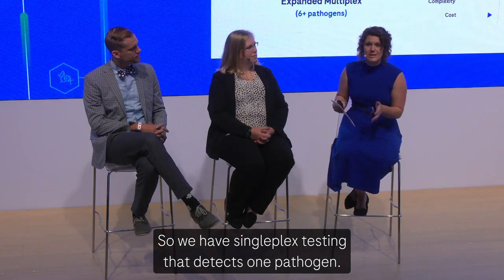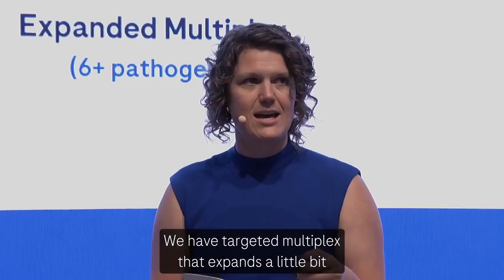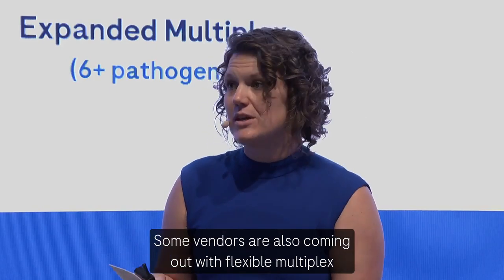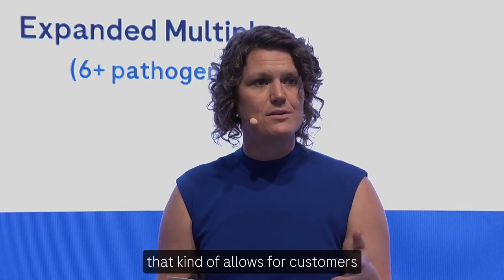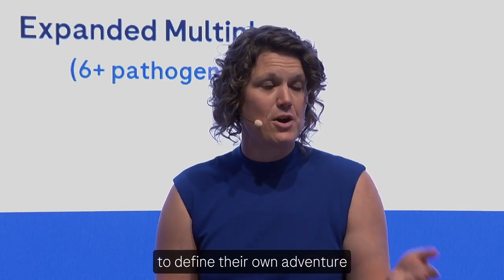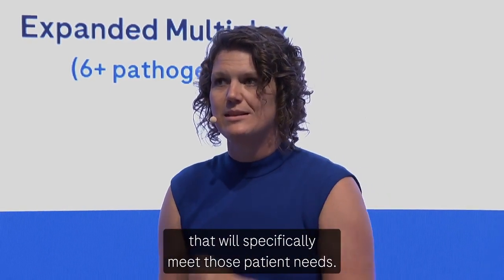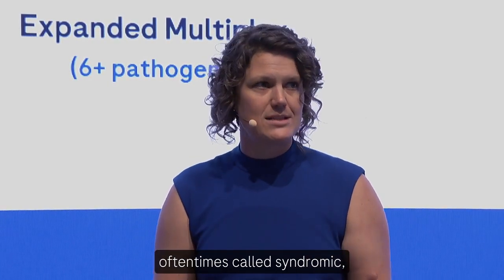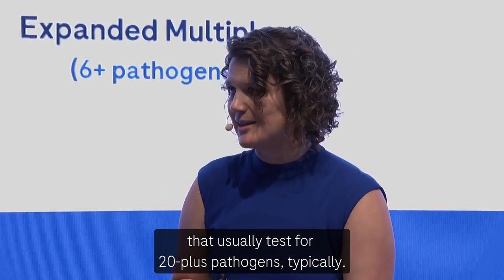So we have singleplex testing that detects one pathogen. We have targeted multiplex that expands a little bit to have 2 to 5 pathogens. Some vendors are also coming out with flexible multiplex that allows customers to define their own adventure and choose whatever panel they want that will specifically meet those patient needs. And of course, we have the expanded panels, often called syndromic, that usually test for 20 plus pathogens.